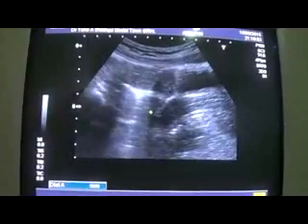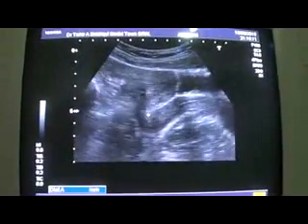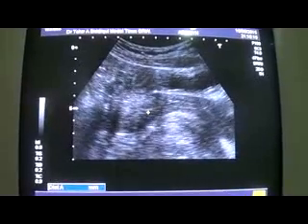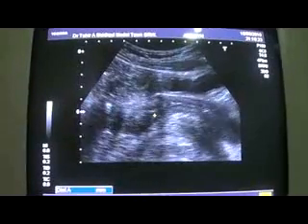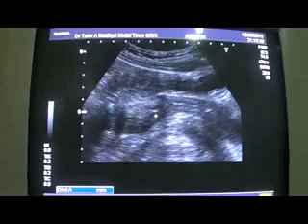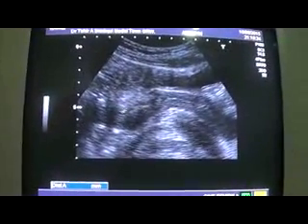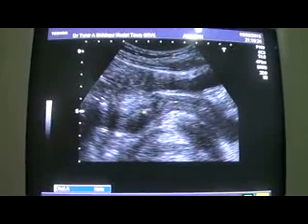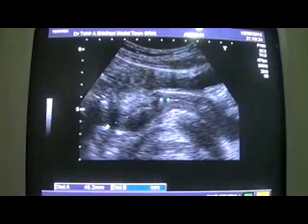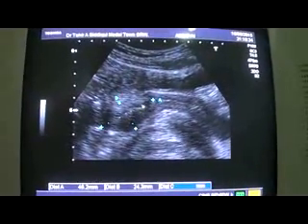Now when I move the probe posteriorly and inferiorly, I come across another tubular structure which is giving the shape of a uterus, and this is the second uterus in this female. It is retroverted, rather retroflexed. Here we are. You see, this is the endometrial lining, this is the vagina, and here is part of the cervix. It measures 4.6 centimeters by 2.4 centimeters, is small in size, and this is the endometrial canal.